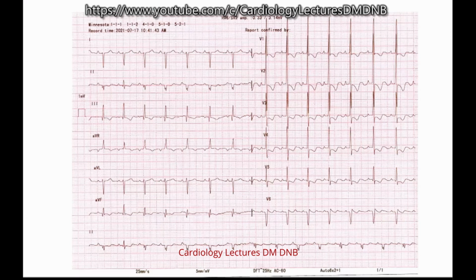In full standardization, ma'am, isn't it? It will be around 250, ma'am. Yeah, 225 or 200 maybe, but then you've got ST-T changes, therefore you have to think about very high RV pressure because you've got a strain pattern. So this is RAD, RVH with strain.